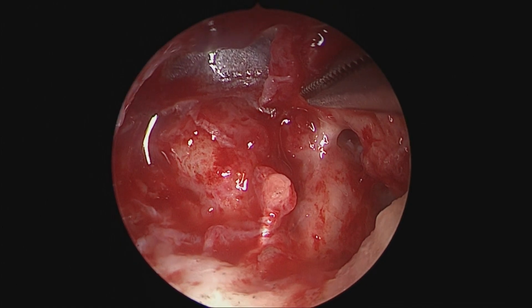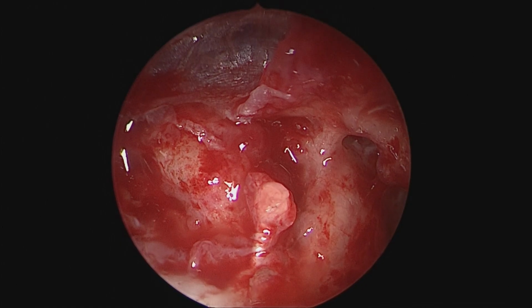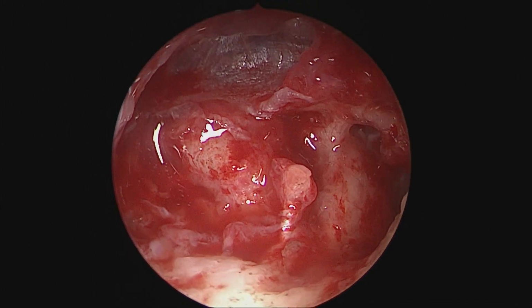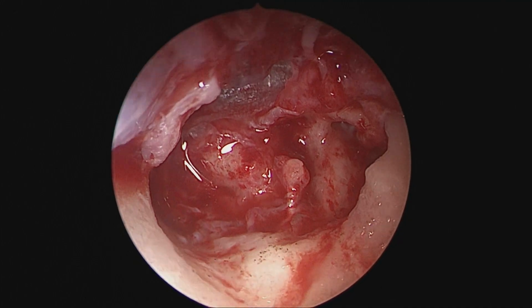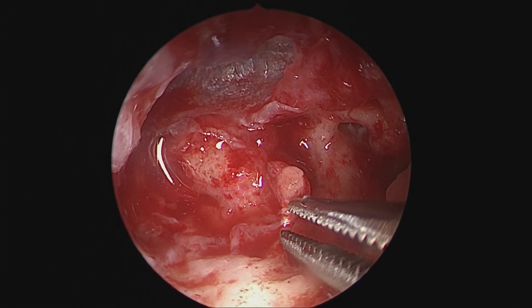This is a wonderful view of the middle ear that we get through an endoscope without any significant drilling or curettage. And as you can see, the posterior mesotympanum, both superiorly and inferiorly, is very well visible as compared to microscopy. So for posterior mesotympanic diseases, I think endoscopic surgery is a great tool.